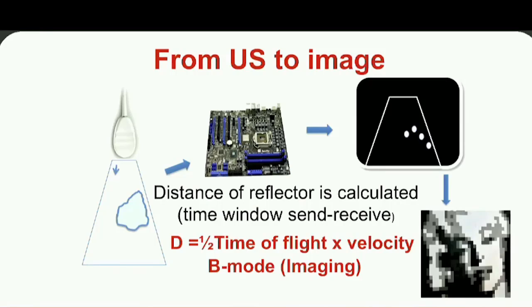Now, how does this get translated from ultrasound to image? Once you have the transducer, the ultrasound machine starts vibrating these crystals in short pulses. Once the vibration takes place, the vibrations go through the human tissue and encounter an object where there is a reflection. This reflection comes back, and depending on the depth of the reflection, the echoes are produced on the screen as dots.